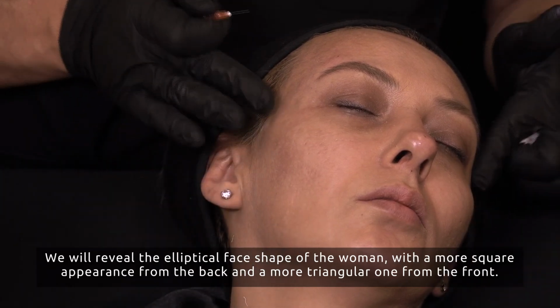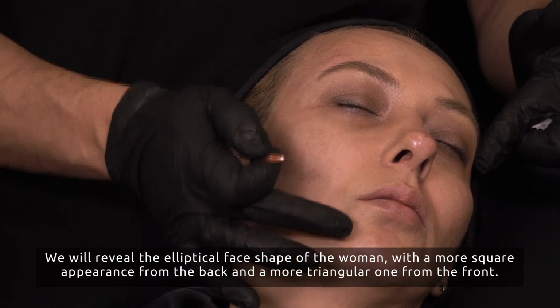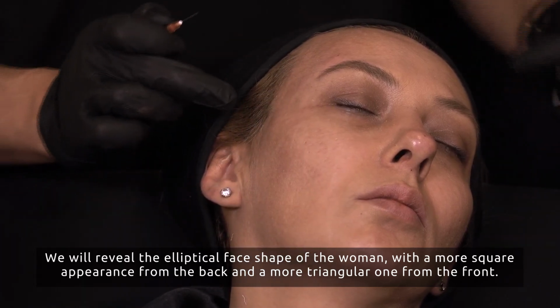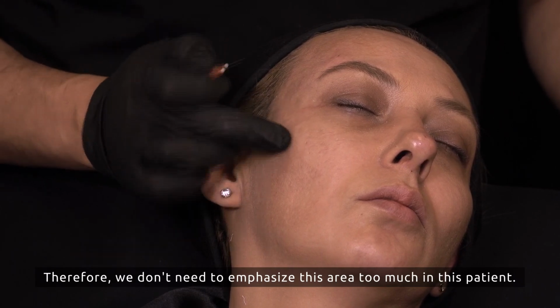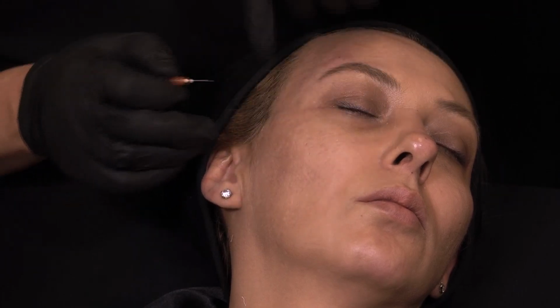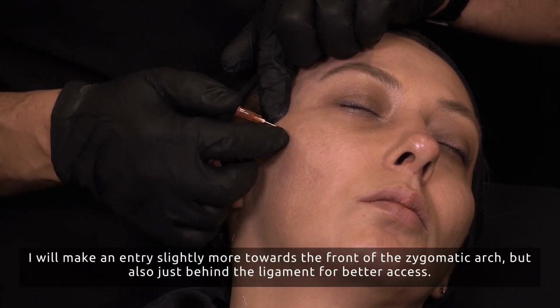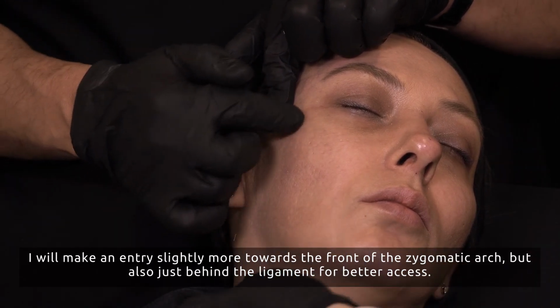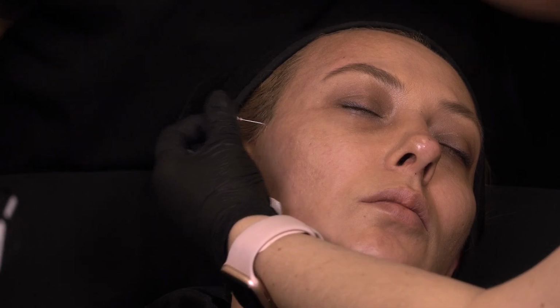We will reveal the elliptical face shape of the woman with a more square appearance from the back and a more triangular one from the front. Therefore, we don't need to emphasize this area too much in this patient. But this area can be slightly elevated. I will make an entry slightly more towards the front of the zygomatic arch, but also just behind the ligament for better access.